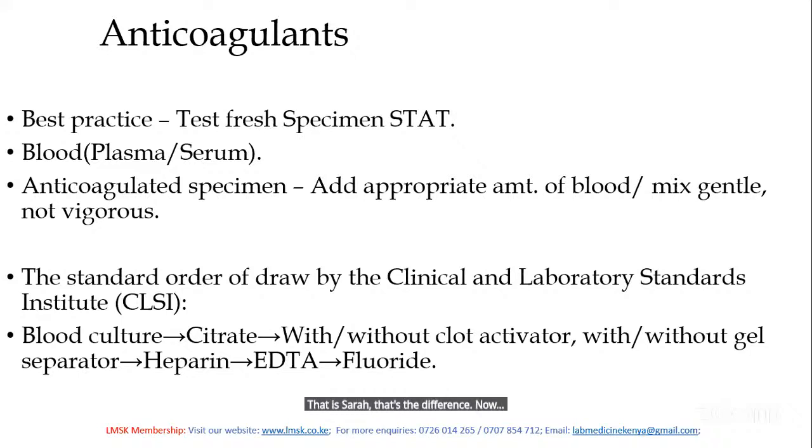Now, as you are drawing the blood, maybe you have multiple tubes for multiple tests going to different sections. It is the same patient, but specimens going to hematology, bacteriology, clinical chemistry, and some other places. That is multiple draw. Then the Clinical Laboratory Standards Institute recommends that you follow the following order, strictly that order, that you start filling the blood culture tube.